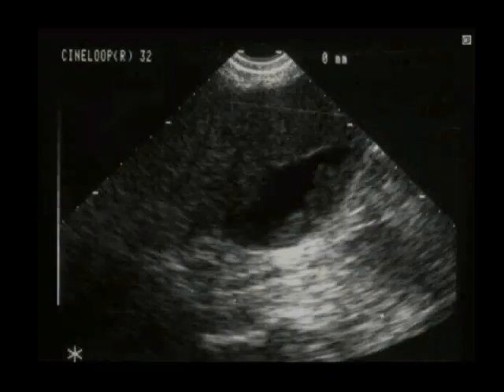Here's another patient that we're scanning, the right upper quadrant. We've found the gallbladder. Question is, is this a gallstone? Are these multiple gallstones? What do you guys think? No. No shadow. So it does not meet criteria.